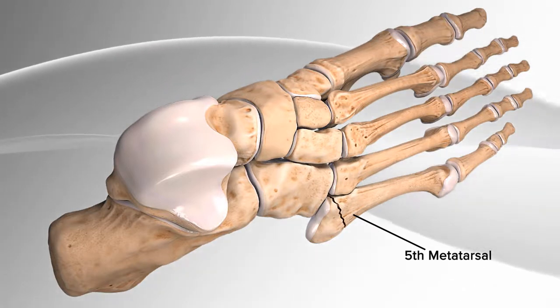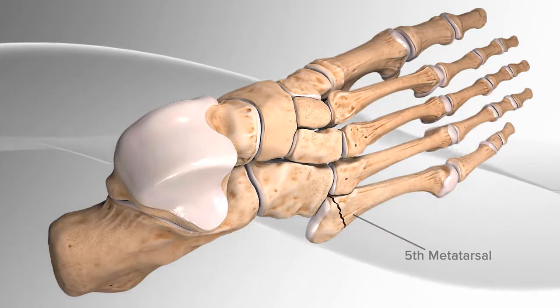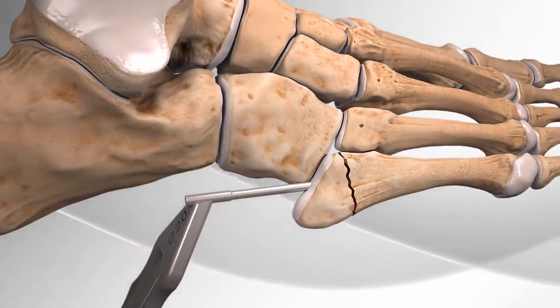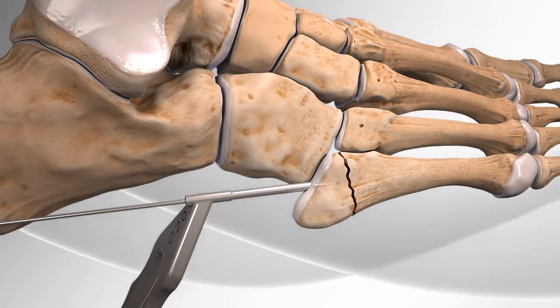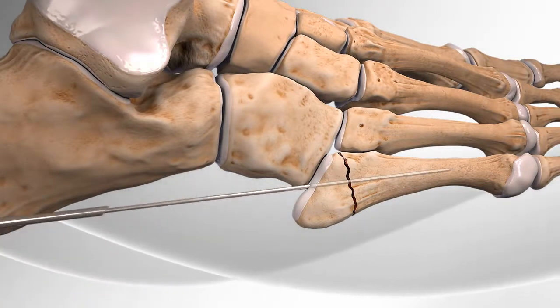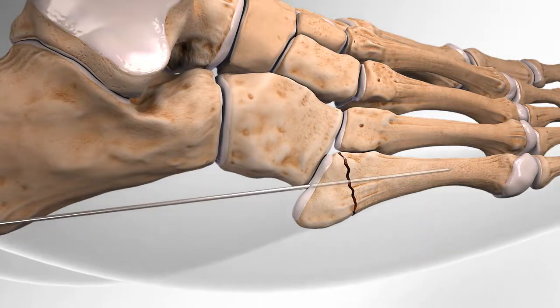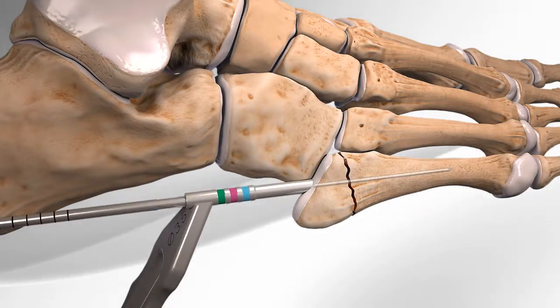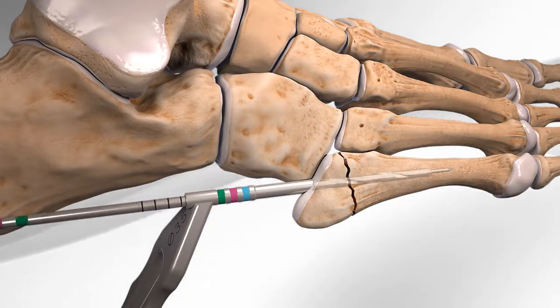The broken bones are held together by using a surgical screw. First, the surgeon makes an opening in the skin and inserts a smooth stainless steel pin through the base of the bone, just past the fracture line. The surgeon then drills past the fracture site and avoids drilling the outer shell of the bone.